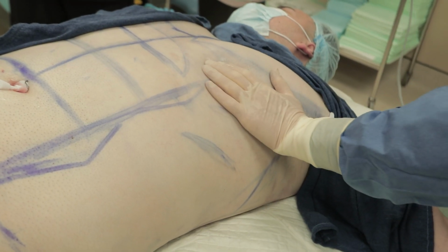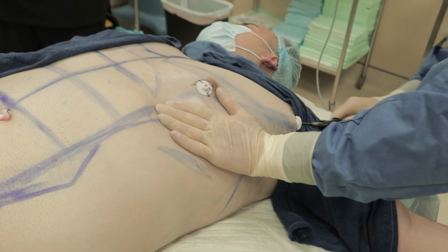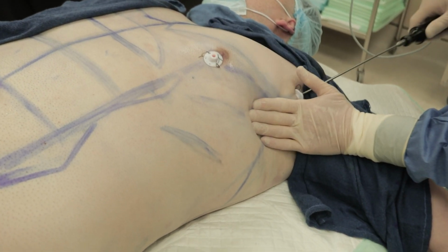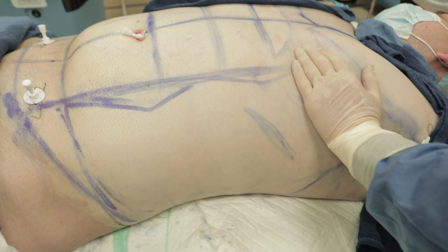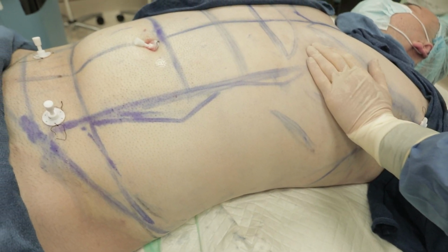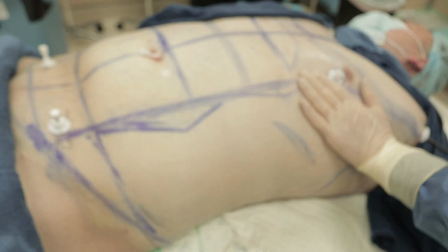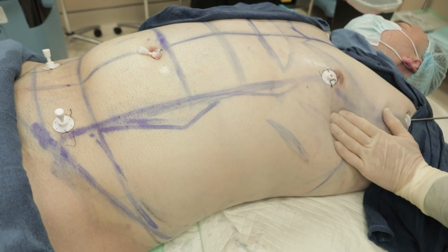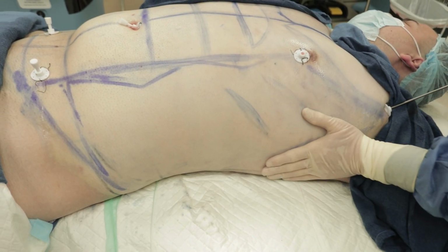And I also go for feel, because I'm melting this gland and the fat of the chest. Spend some time right underneath the nipple and carve the lateral pecs. In about 15 seconds, I'm going to head towards the lats. Perfect. I use my smart hand to feel everything, feel the resistance and feel the anatomy. 2 minutes to go. Good. Now, at that 2-minute part, we're going to go towards the lats.